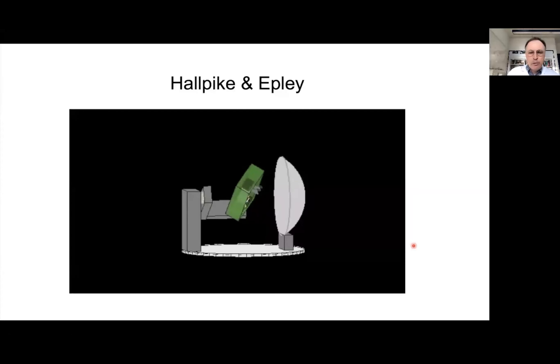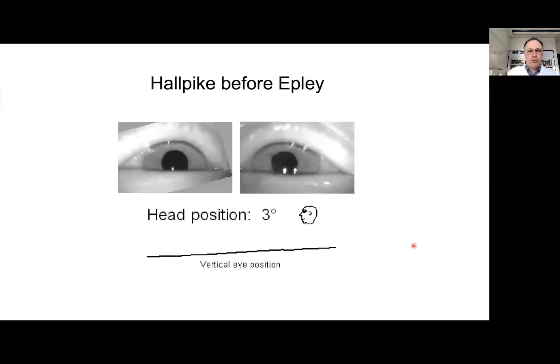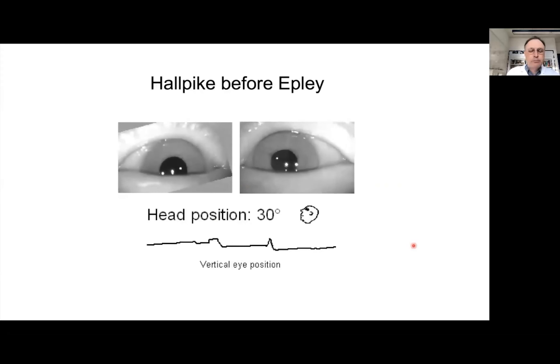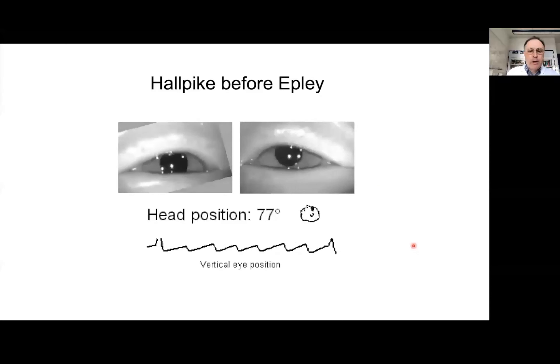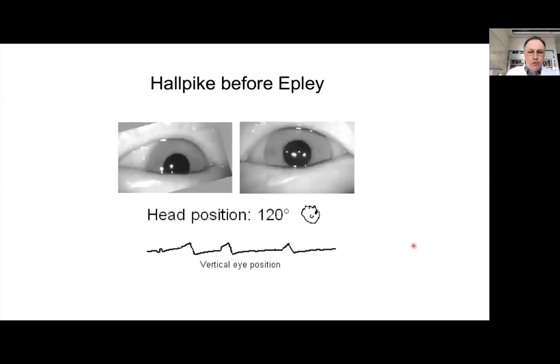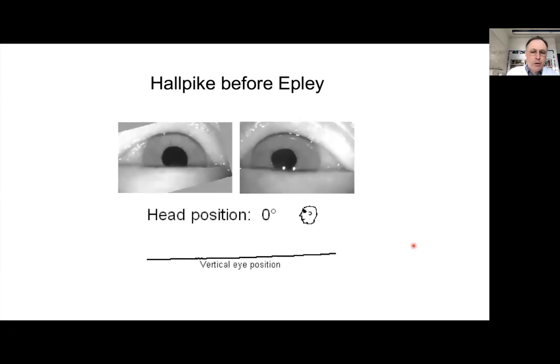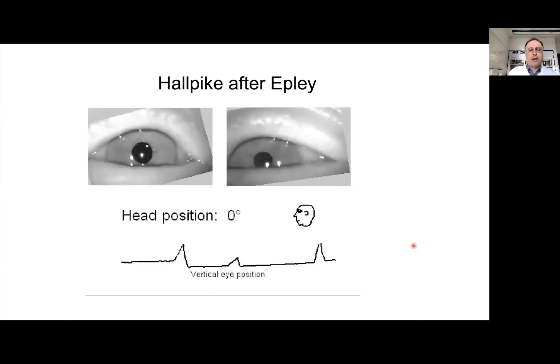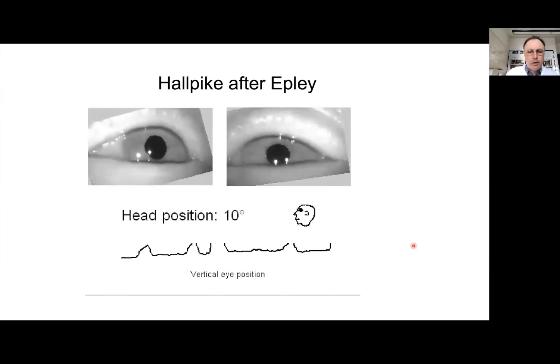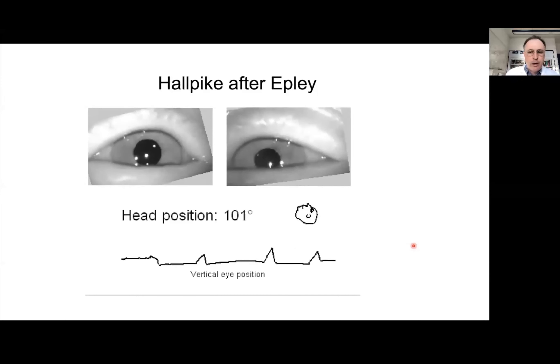This demonstrates how we perform the Dix-Hallpike and Epley maneuver on the turntable. With the motor, we were also able to do some shaking in the head-hanging position. Here is a patient being moved into the 30-degree head-hanging position — I believe on the right side — and again, with some latency, a nystagmus appears. The subsequent Dix-Hallpike after the Epley maneuver clearly shows that the nystagmus no longer appears, confirming successful treatment.